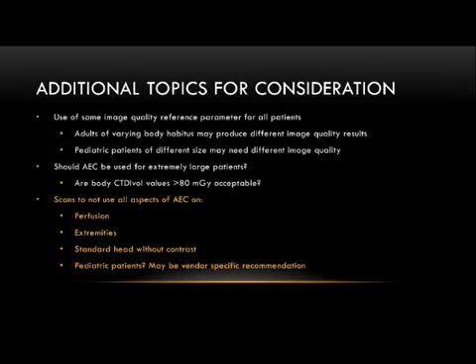Again, some vendors recommend that for your standard non-contrast head CT you not use tube current modulation. Some will let you use it. I think that's really an institutional experience and desire. As I mentioned before, some institutions really do recommend using tube current modulation on pediatric patients. Some say no, it's not a good idea, use a fixed technique. So these are all, again, open questions: practice dependent, vendor dependent, and radiologist preference dependent.